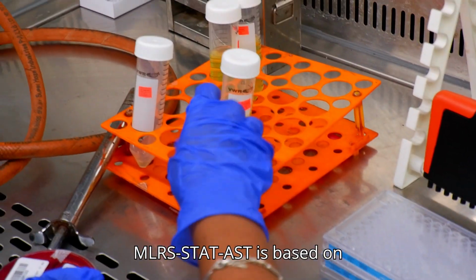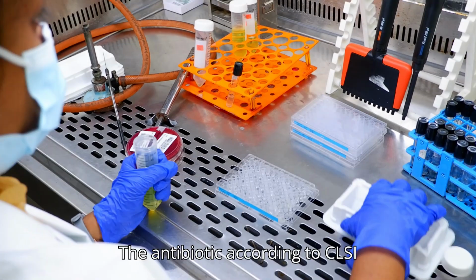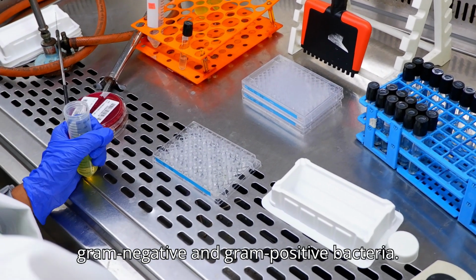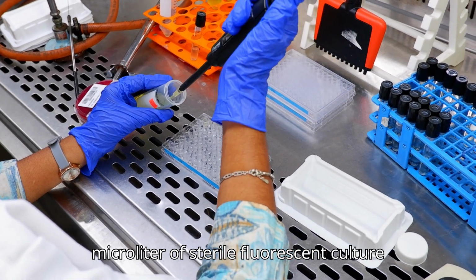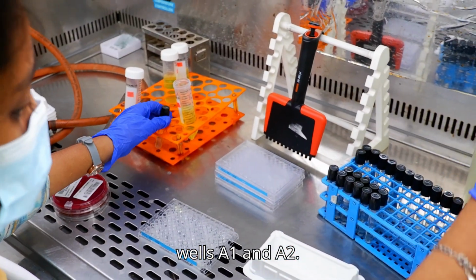MLRS STaTAST is based on the CLSI broth microdilution method. The antibiotics, according to CLSI breakpoints, are coated onto a microtiter plate with specific panels for gram-negative and gram-positive bacteria. Using a single-channel pipette, 200 microliters of sterile fluorescent culture medium is added to the negative control wells, A1 and A2.